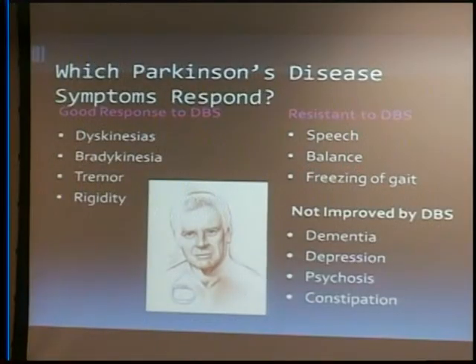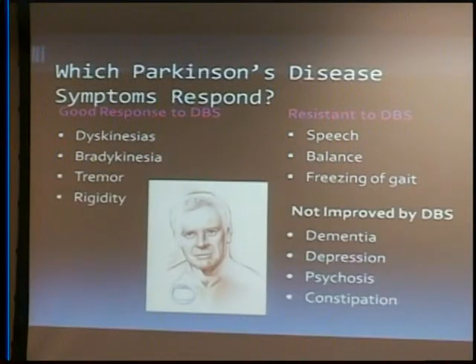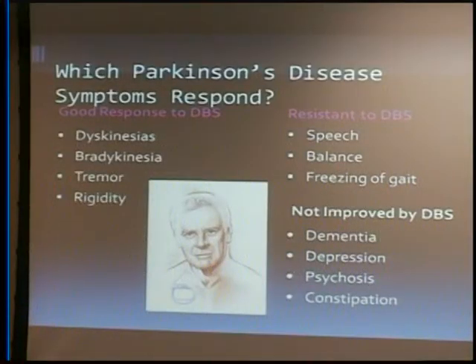Balance is a difficult one, and gait overall is difficult because, again, that's often a common concern of patients prior to DBS. They're saying, I'm not walking very well and I'm falling. Will DBS do that? And I always say to patients, in general, I'm not sure, unfortunately, prior to surgery. I can't often give people a good answer to that specific set of symptoms.